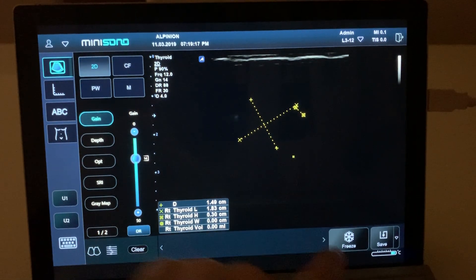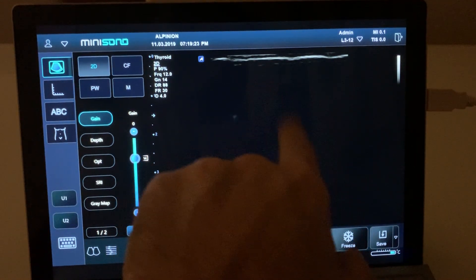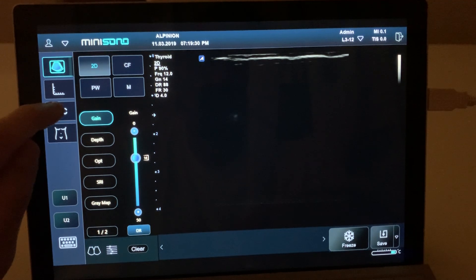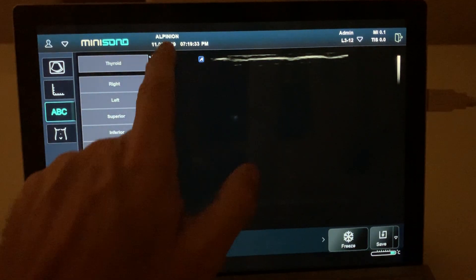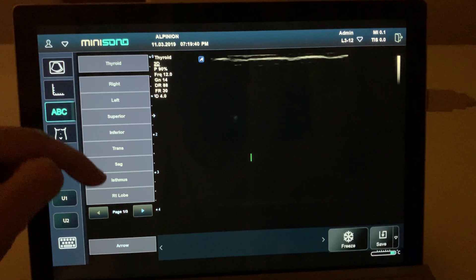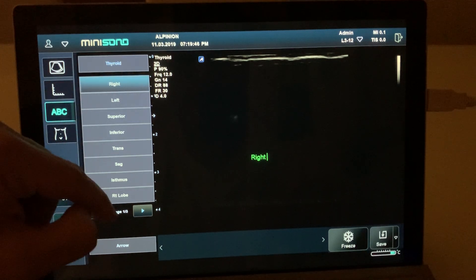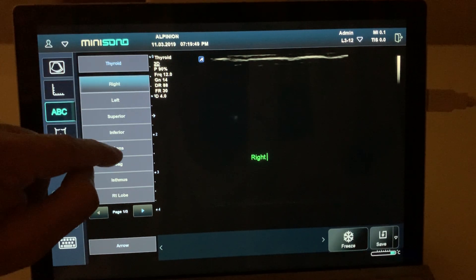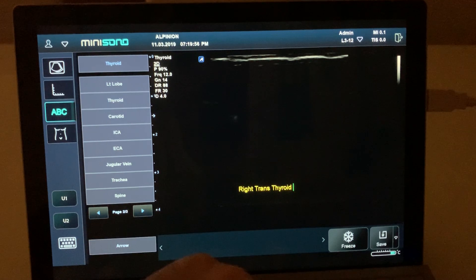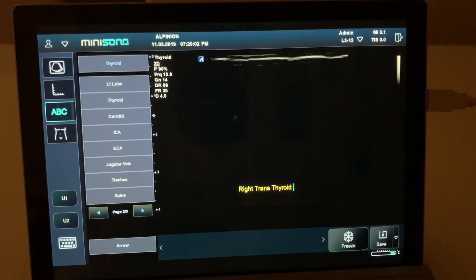To exit to 2D, click here in the bottom menu. If you want to clear, just unfreeze — this is the freeze button here. When you freeze the picture all the measurements go away. If you want to do annotations, you see the ABC button here. When you click there you'll see a cursor, and you can use the annotations available in the menu — for example, 'right transverse' and then 'thyroid'. You can use your finger to drag the annotation.